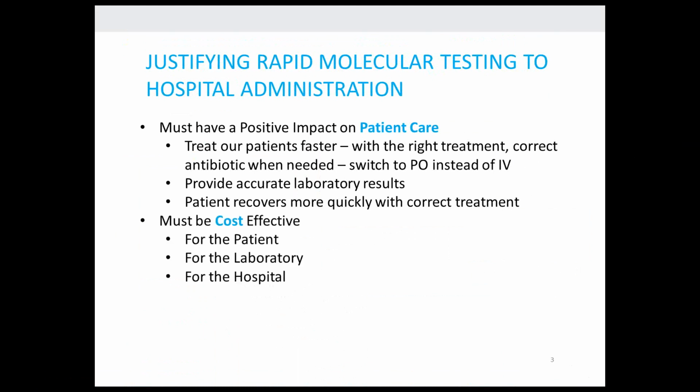In addition, we felt we should give information on whether or not a test is cost effective. So we want it cost effective for the patient, so they're not charged extra things that the physician didn't really think was needed. And for the laboratory, it's expensive on some of those larger panels.